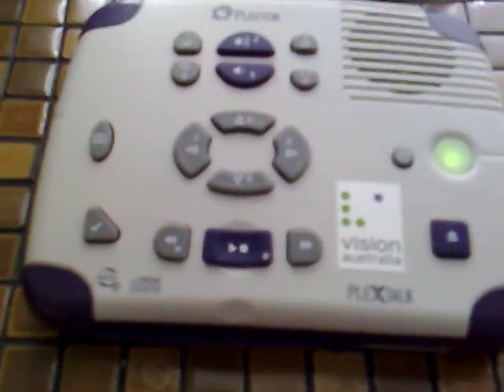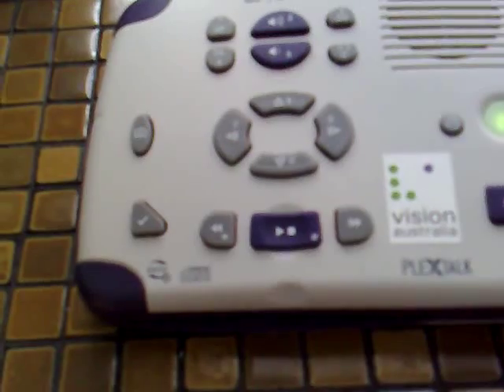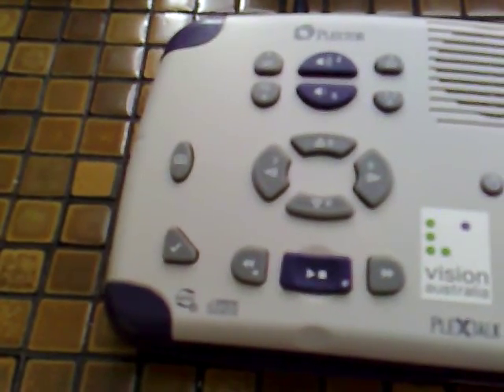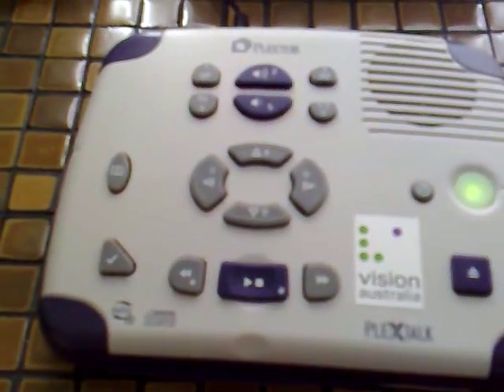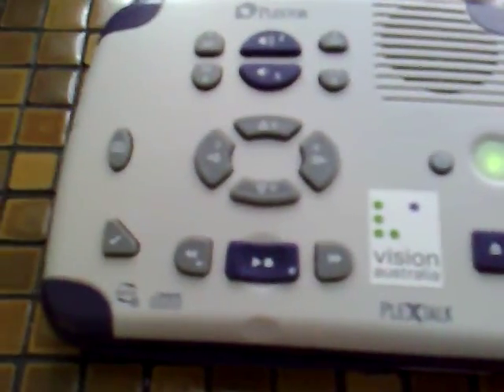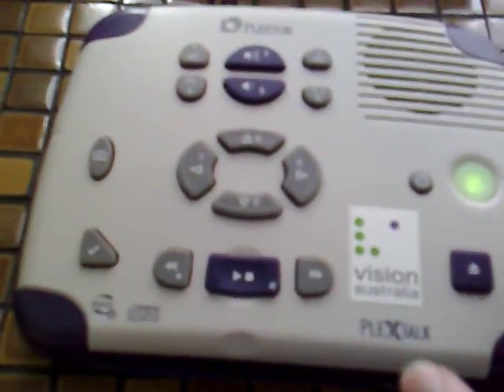The machine announces "Music CD" and it starts playing. When you turn the machine off, it remembers exactly where you stopped listening, whether you're listening to a book or a music CD. Let's start playback. We can also speed up the music CD and slow it down, just as with the talking books. Normally I'd listen to it at normal speed.